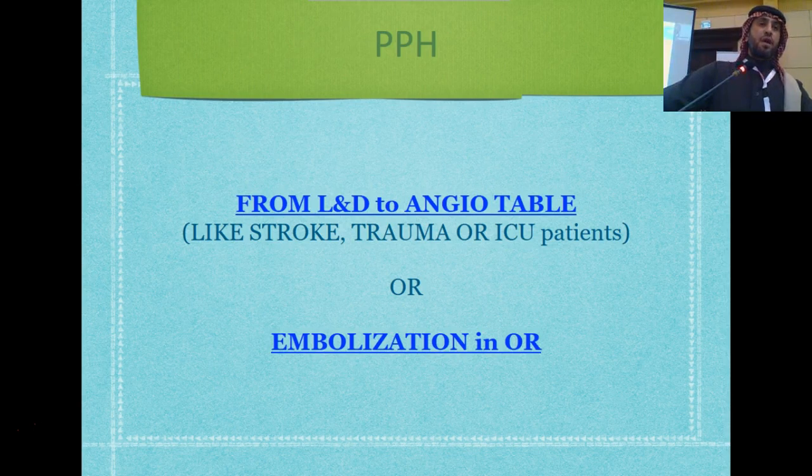The resolution of the C-arm is very different from the angio machine, as if you are comparing two types of cars, a Mercedes and, for instance, a Toyota, with no discrimination. So the machine is very different. If you ask any IR, he would love to do his procedure using the angio suite, not a C-arm. But sometimes you have to go inside the OR and do it.